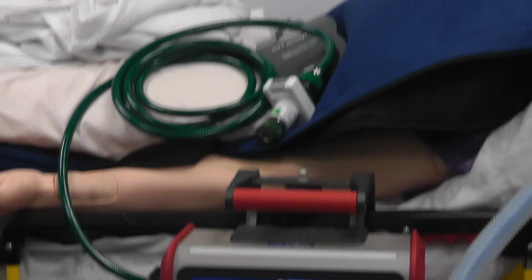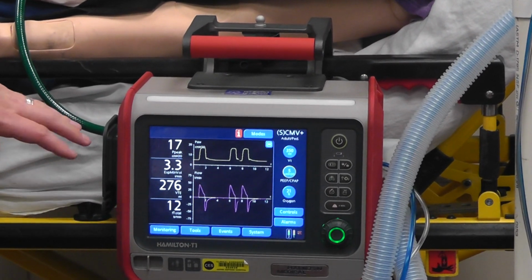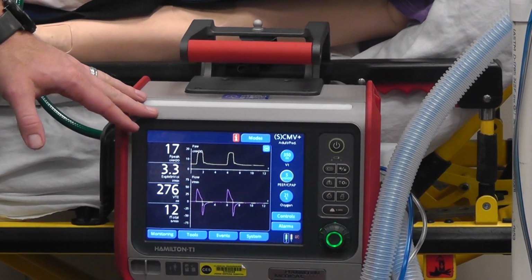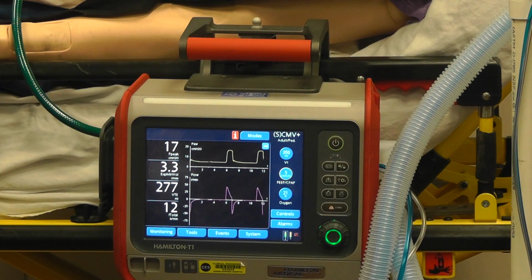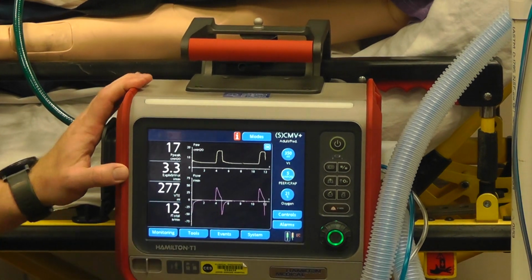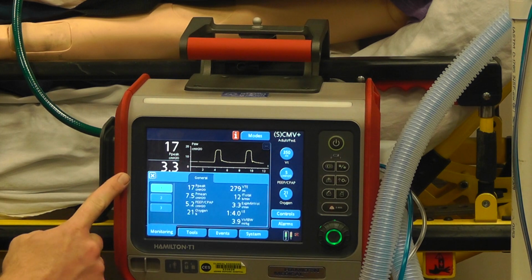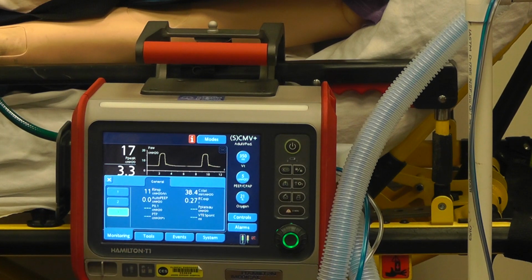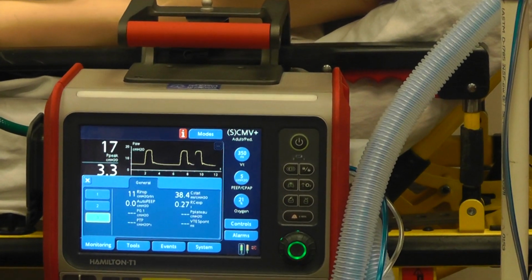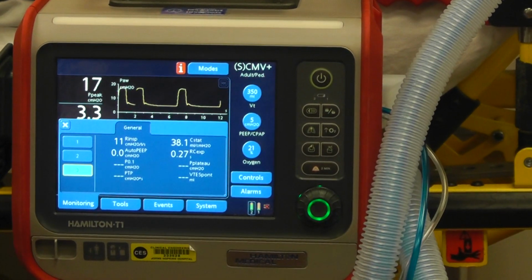The nice thing is, everybody that remembers the LTVs where you actually had to do an inspiratory hold to get a static compliance, with the Hamilton and the advanced monitoring on this ventilator, it does a rolling static compliance on every single breath. So all you have to do is go to the monitoring tabs. I've got them running now at a PEEP of 5. We're going to note the static compliance. It's on page 3 of the monitoring. So you click monitoring and then go to page 3. Right now my static compliance is 38.4. It changes breath to breath, but roughly we're looking at about 38.